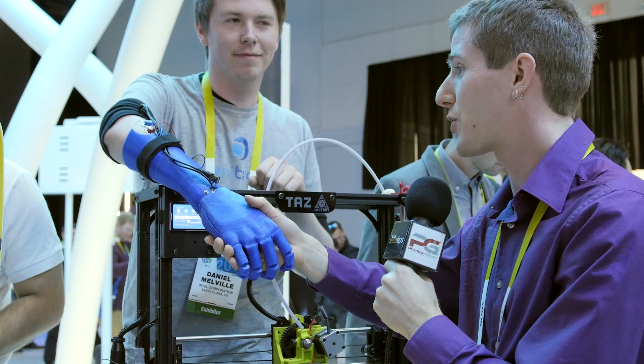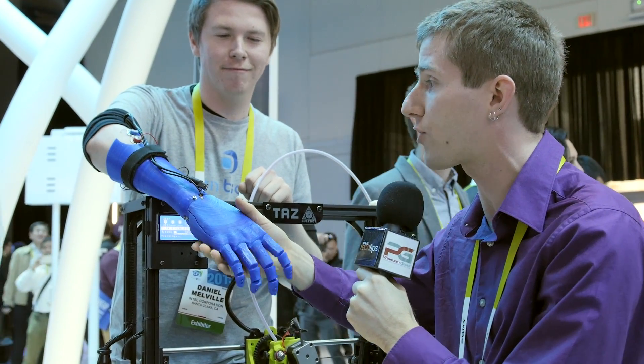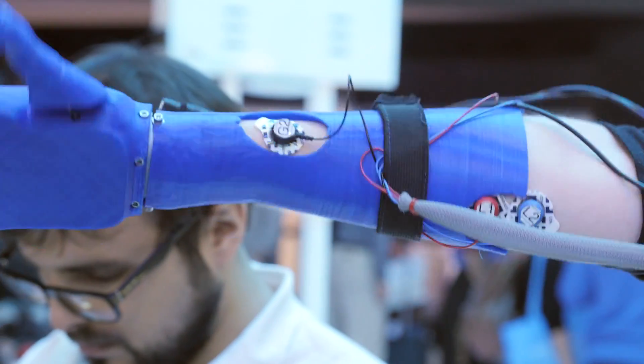That is incredible. The way it works is there are sensors attached to the muscles on Dan's arm here that allow him to control this hand.